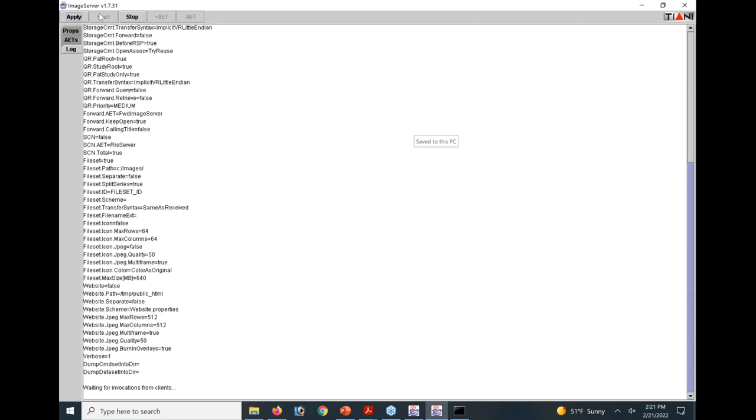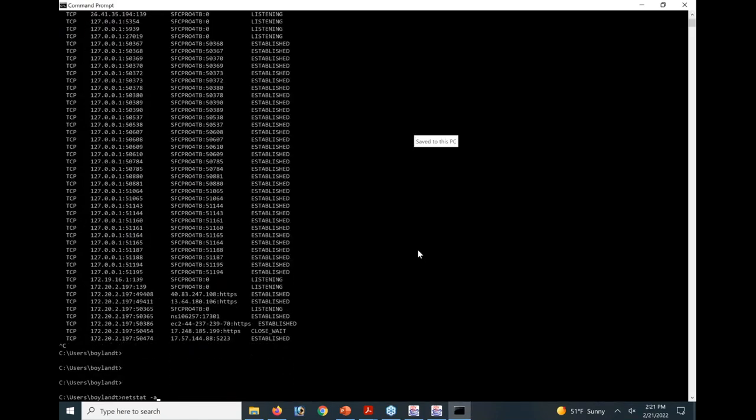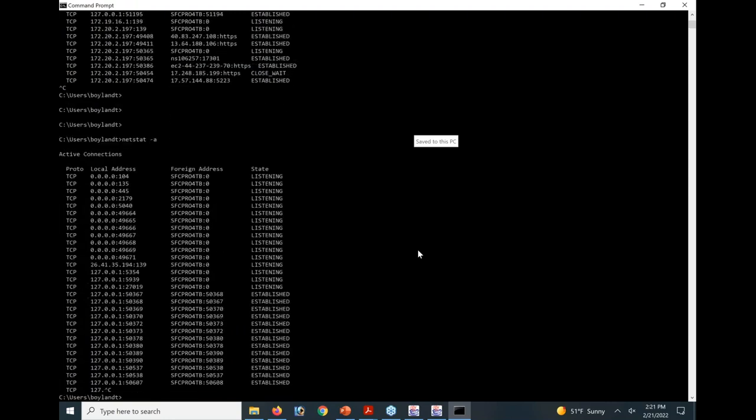So it was that simple, setting up the SCP. So now 104 should be on. Exactly. Now I do the netstat again. And look, I have 104. What's it say? Listening. 104 is listening.